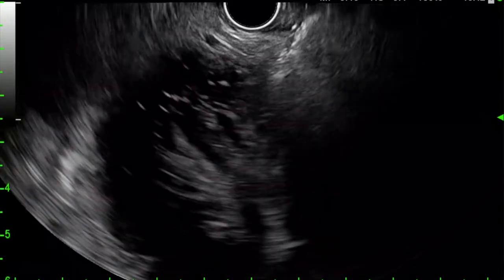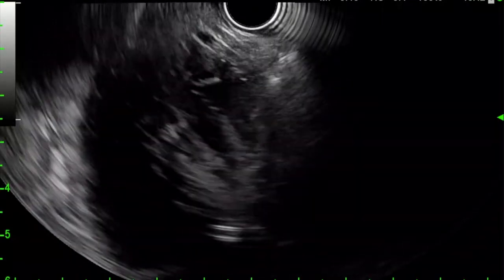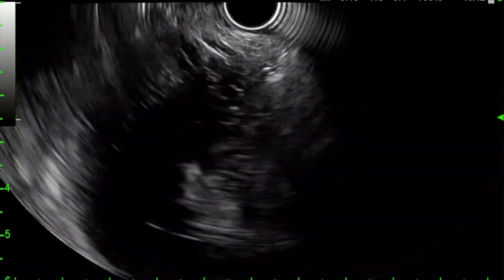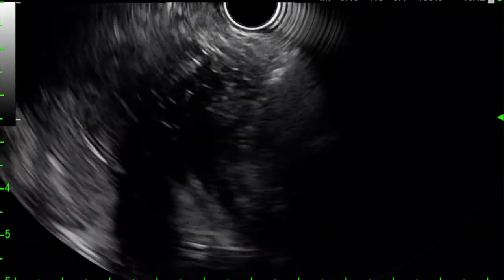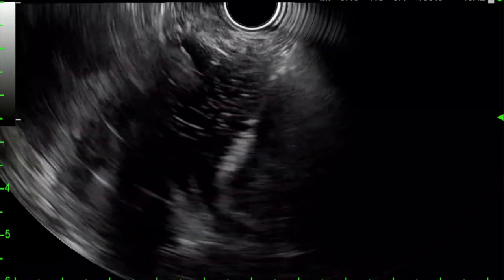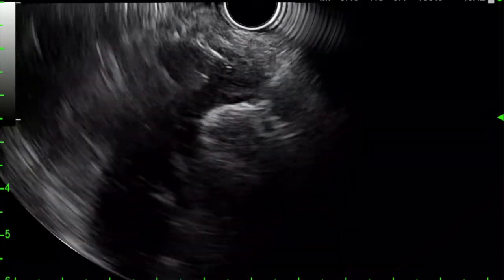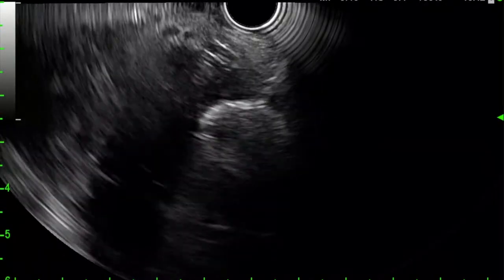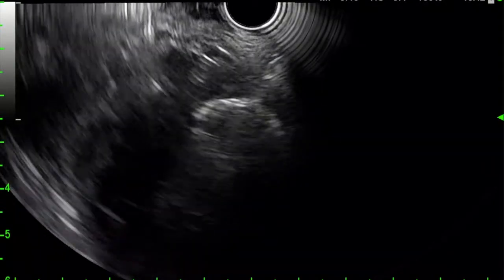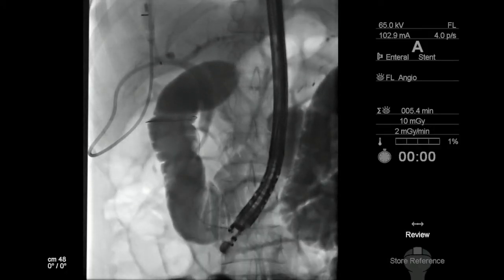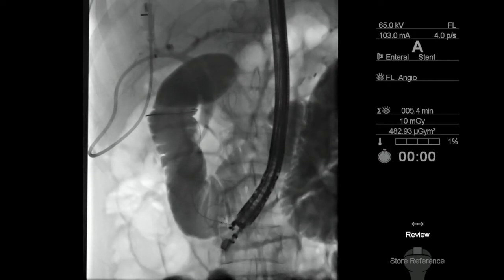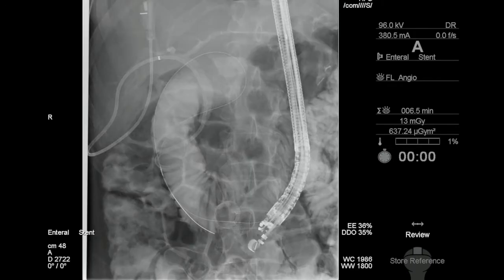A therapeutic channel linear echoendoscope preloaded with the LAMS catheter and a long guidewire was advanced into the jejunal Roux limb in close opposition to the jejunal pancreaticobiliary limb. An electrocautery-enhanced lumen-apposing metal stent catheter was advanced through the small intestinal wall of the Roux limb and into the pancreaticobiliary limb. The distal flange was deployed under endosonographic and fluoroscopic guidance into the small bowel, and the proximal flange was deployed under endoscopic visualization within the Roux limb. The preloaded guidewire was then advanced and coiled into the pancreaticobiliary limb.